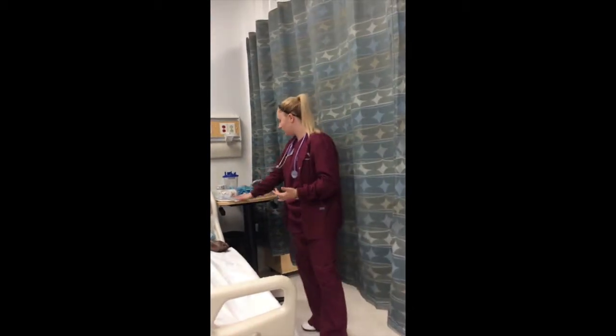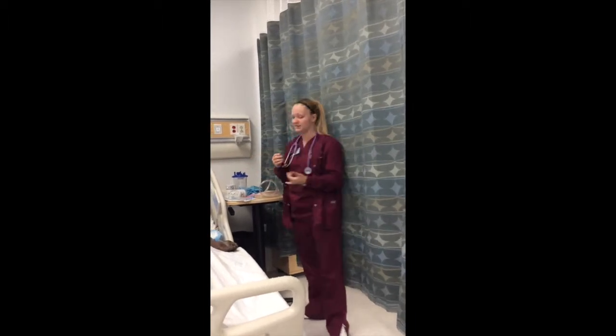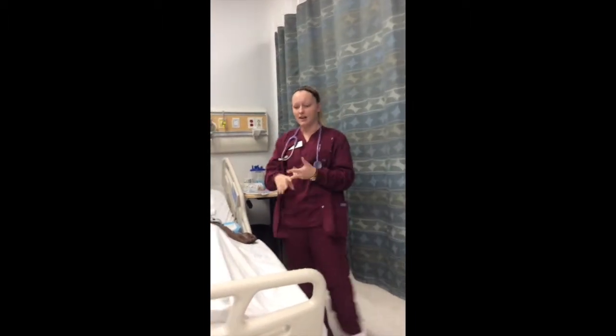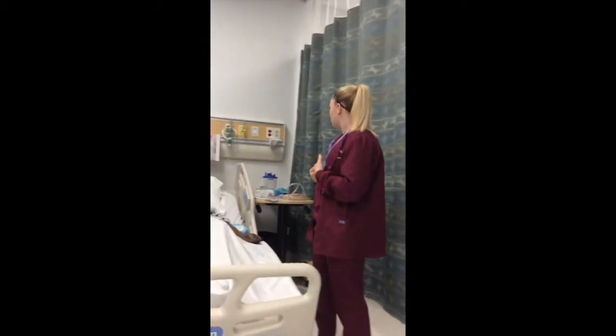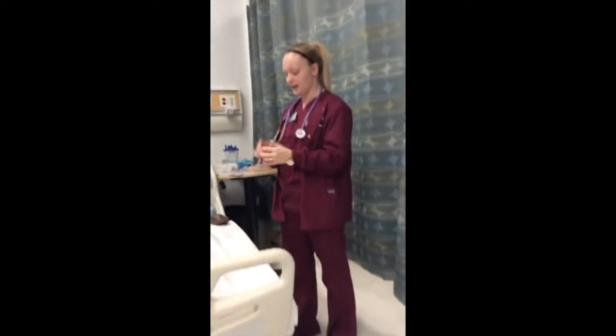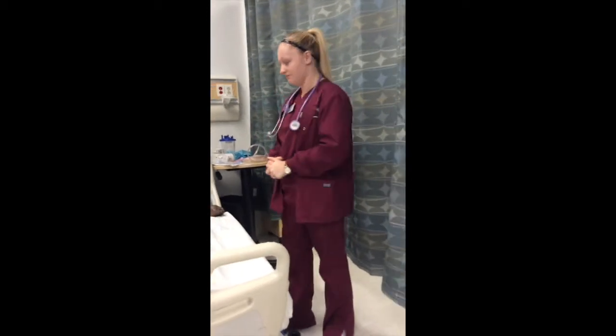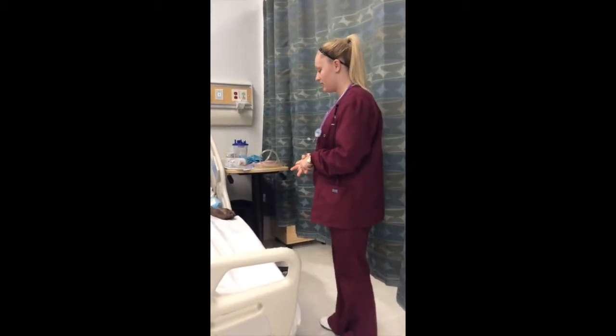I'm going to need my tube, I'm going to need my little valve, and I'm going to need all of the suction equipment. I'm going to need some lubricant, I'm going to need some tape, I'm going to need a chux pad. I'm also going to need a syringe and my stethoscope. And I'm also going to need a cup and a straw so they can take drinks. And then I'm going to need a little clothespin and a rubber band. So after I've gathered all my supplies, I'm going to go ahead and head to the room with them.